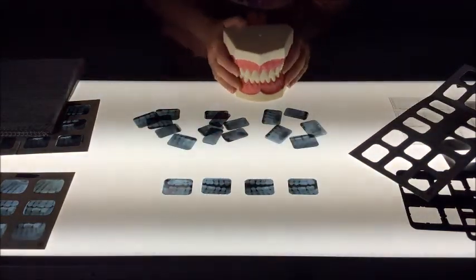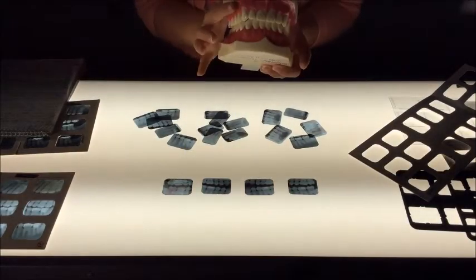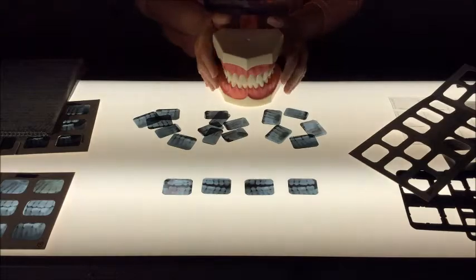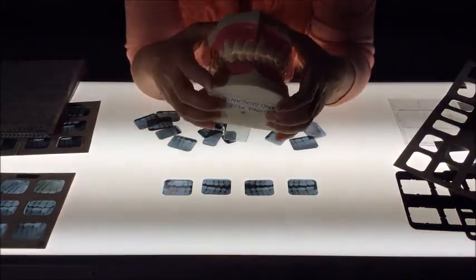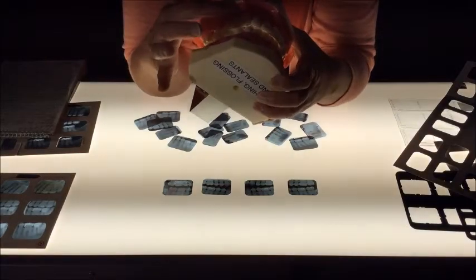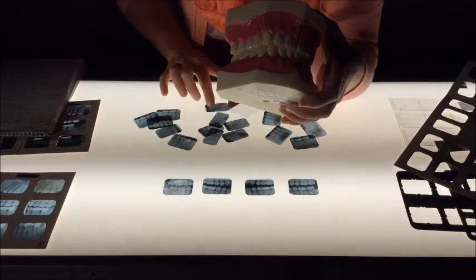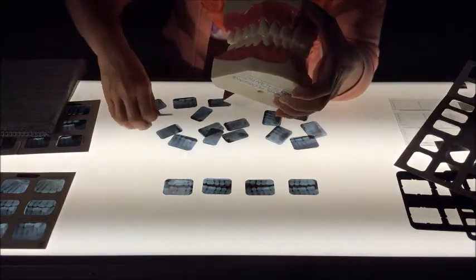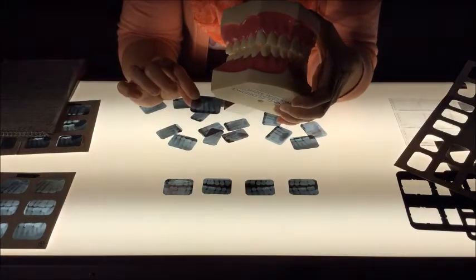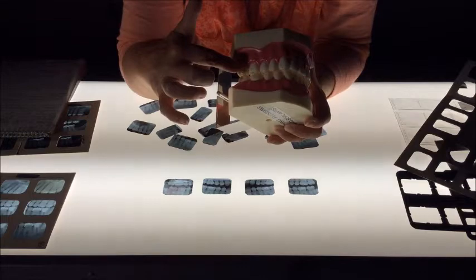The next step that we would look for is our posterior periapicals. Posterior would be the back teeth, both top and bottom. Some helpful anatomical hints for you. Generally, the maxilla is a jaw that's hollowed out by sinuses. So the appearance, when we look at the periapicals that are black and white, is like a black cloud with a white lining above the roots of the teeth, whether it's the premolars or the molars.